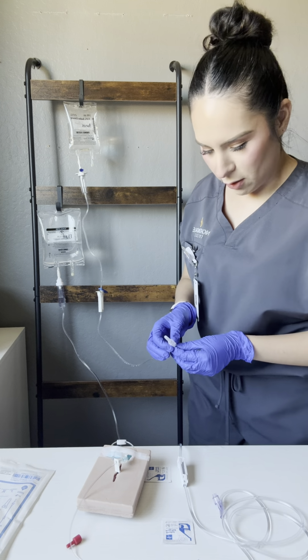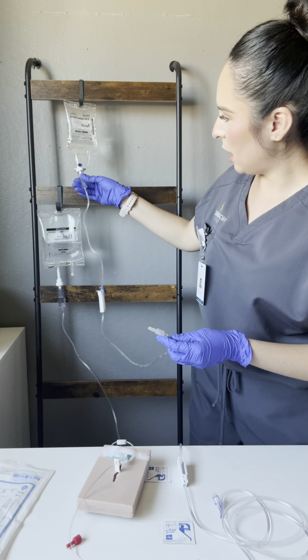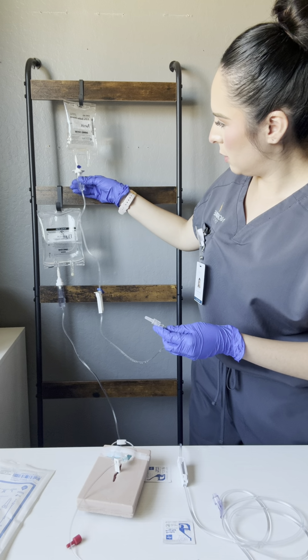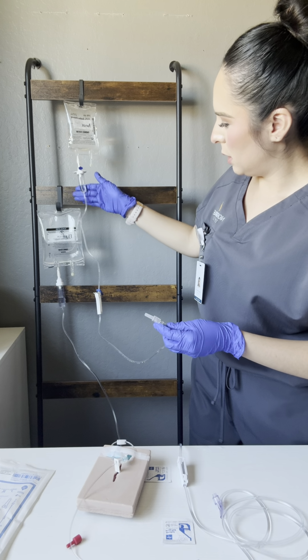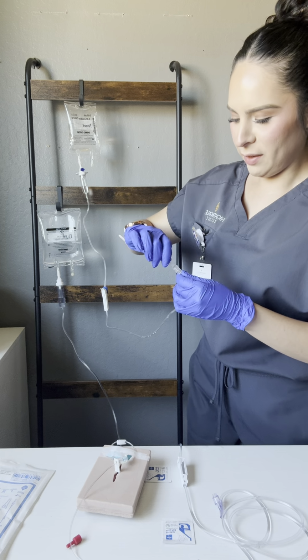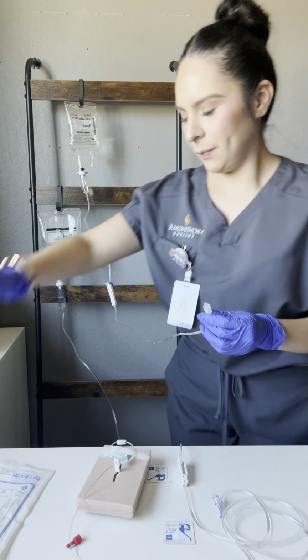And then we are going to want to fill the drip chamber. And then we're going to want to prime our line. So removing the end cap from the adapter end.